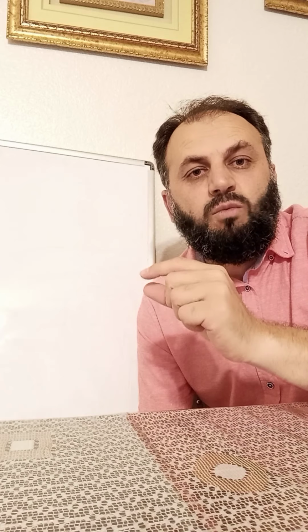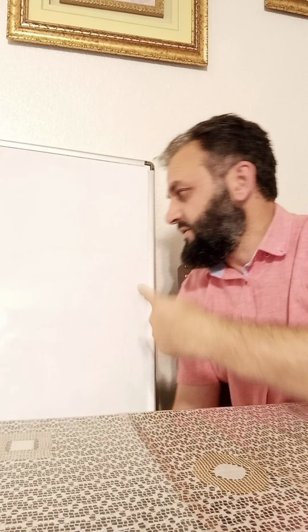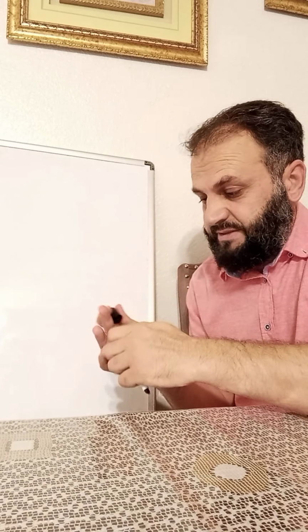If we want to do pulse wave Doppler on the RVOT, or if it's related to the pulmonary valve, it depends where we are looking. So it all depends on our sample volume, where we put our sample volume or gate size. So quickly I will show a little bit on this whiteboard, hopefully that could help us. Be with me. Thanks a lot.